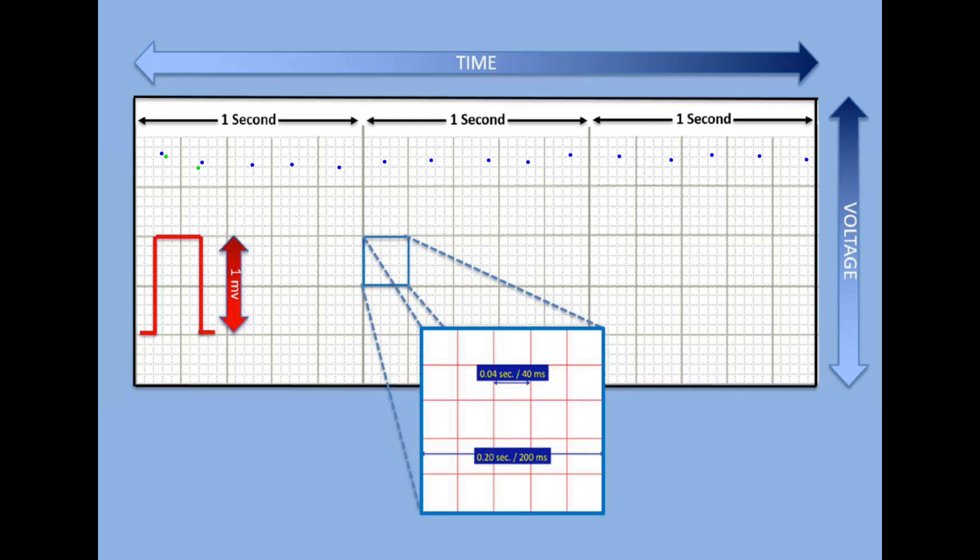Remember I told you that two large boxes in height or 10 small boxes is one millivolt. The voltage criteria isn't super important, maybe a little more when interpreting 12-lead EKGs, but when it comes to rhythm interpretation, it's a lot about these time components. Just to review one more time, every small box is 0.04 seconds or 40 milliseconds, and every large box is 0.20 seconds or 200 milliseconds.